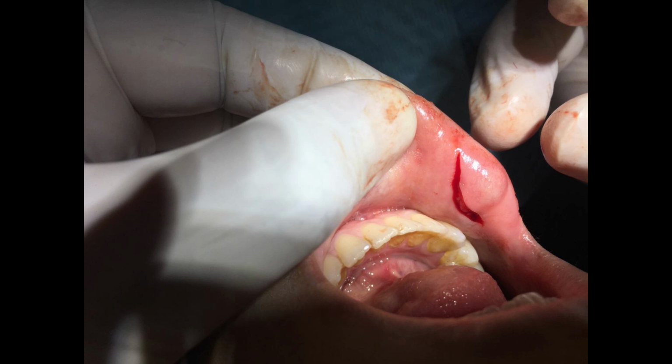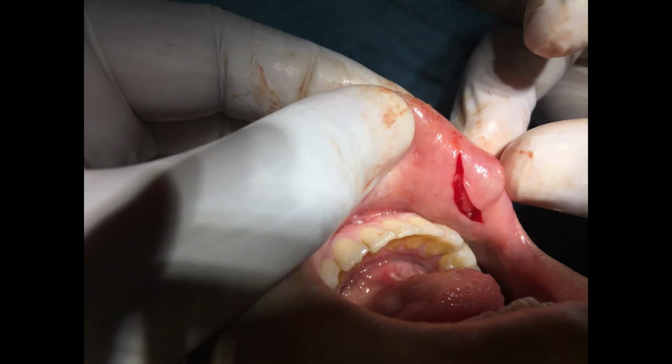To start with, we made an elliptical incision, as is very common, along the base of the mucocele facing towards the sulcus area, and we exposed the mucocele very carefully to ensure that none of it was ruptured. The objective was to remove the whole mucocele along with its sac.